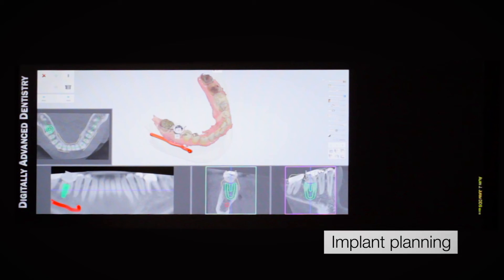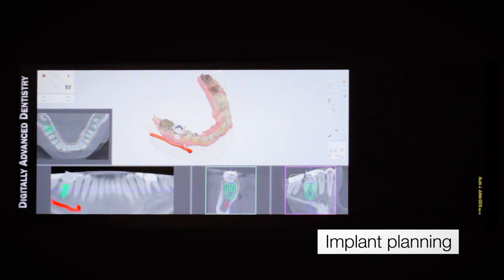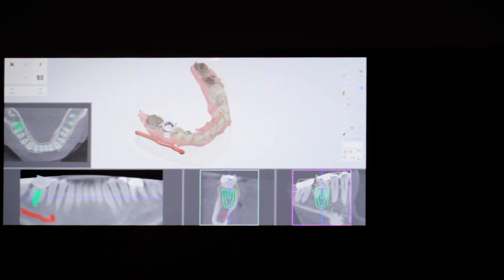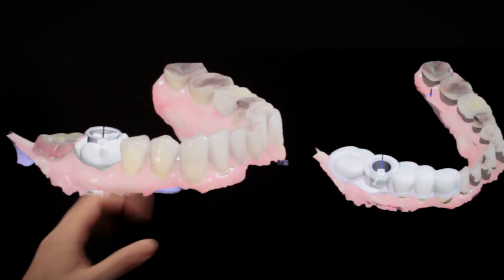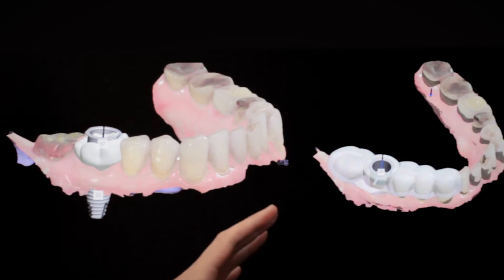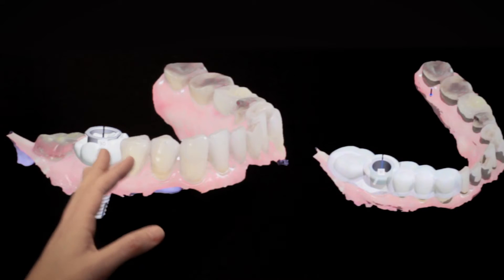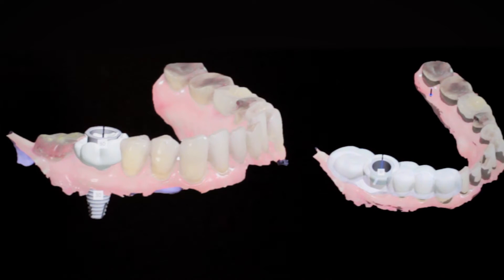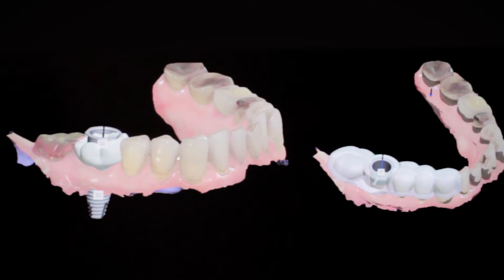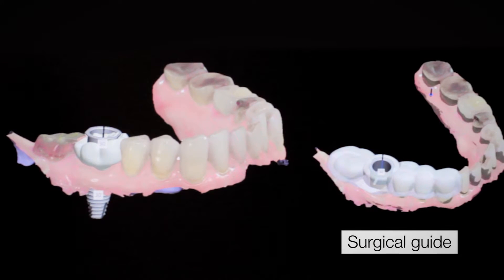The implant planning is put together and planned out after the patient has already left. From there, we're able to go ahead and take our final design, virtually remove the tooth that we want to replace with the implant, and create our surgical guide.